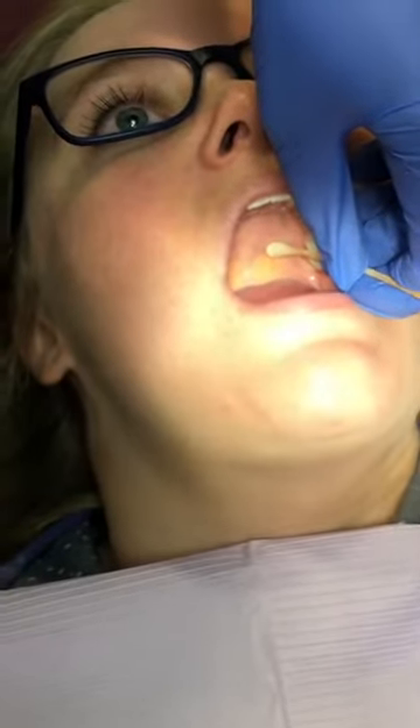Right when you fall into that little depression, that is your GP foramen — your greater palatine foramen. Notice how I'm blanching the tissue. We're going to hold that there for two minutes.